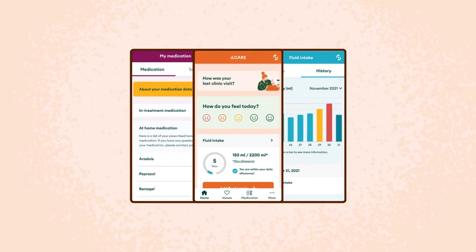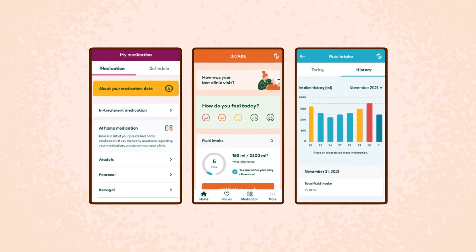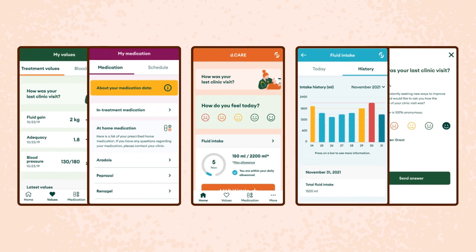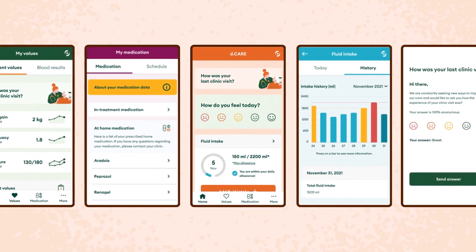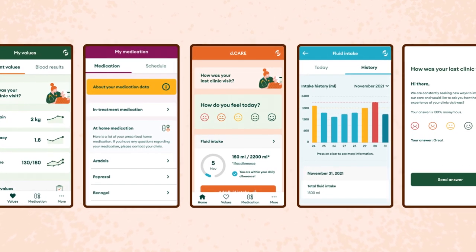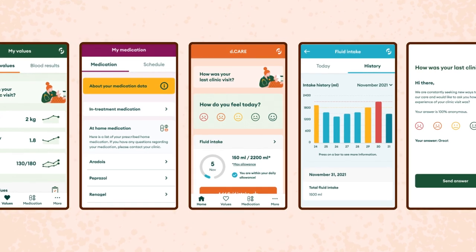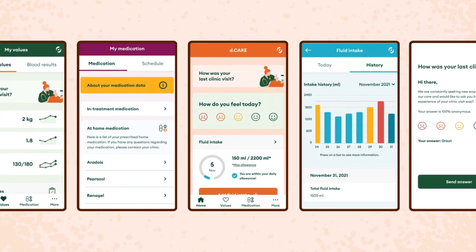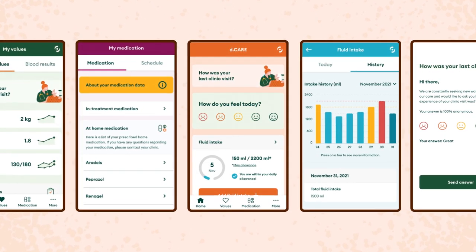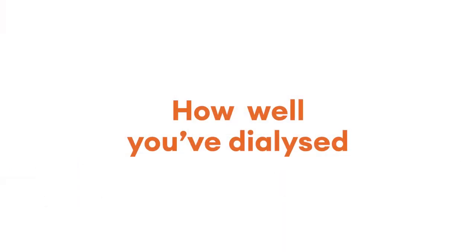Treatment information provided by the D-Care application gives you a full overview of your haemodialysis treatment and is updated following completion of each treatment. You're able to track your blood pressure, obtain data on any fluid gain, and see how well you've dialyzed.